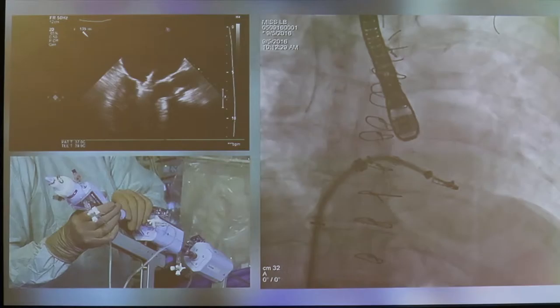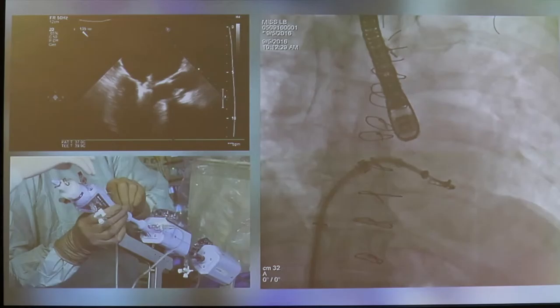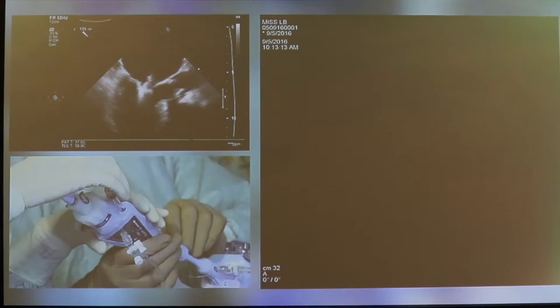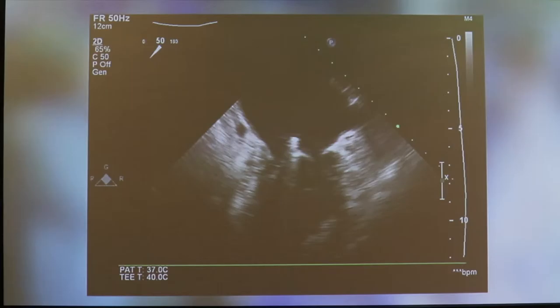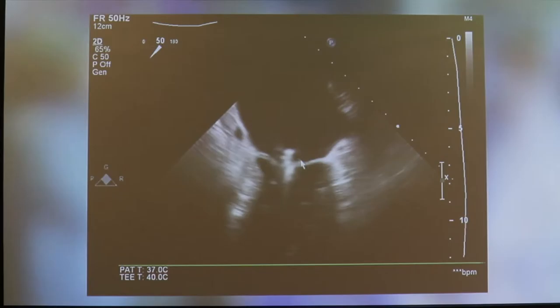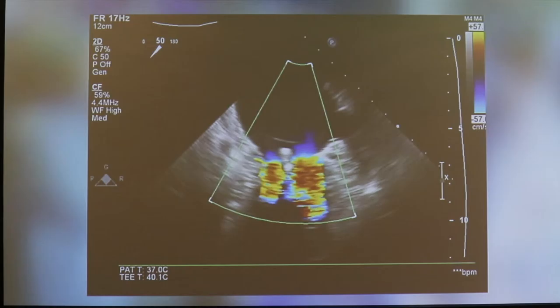Both leaflets are on now. I lower the grippers down and close the clip, then take some tension away — we had overpulled the system slightly to the left edge. Looking in the two-chamber view, the clip is quite central and just a little bit medial, which is the position we were aiming at. There's not really much regurgitation coming back — it's almost gone, just very discreet.